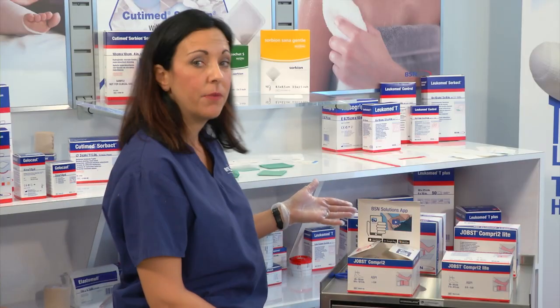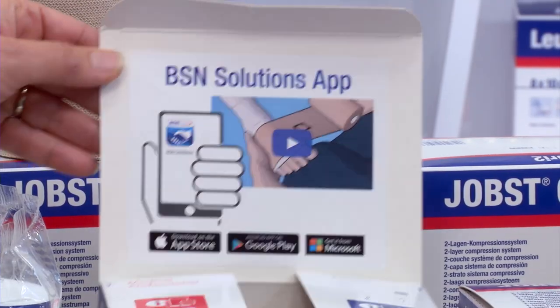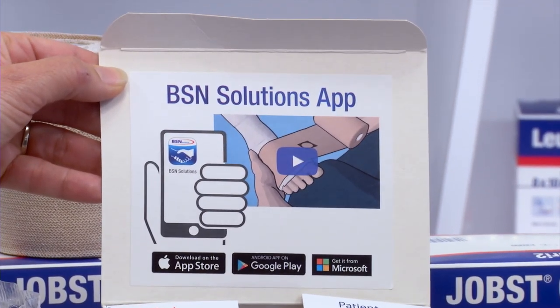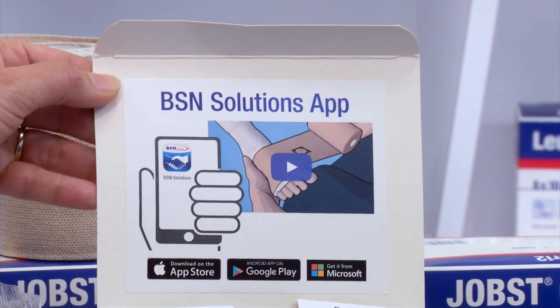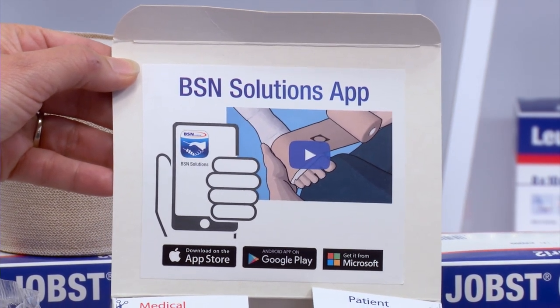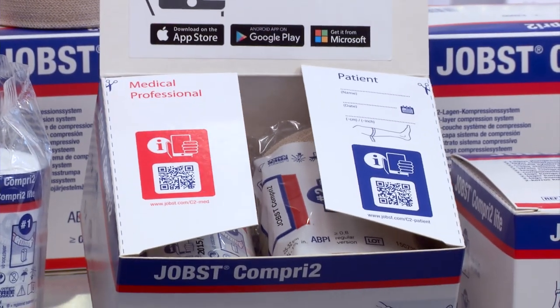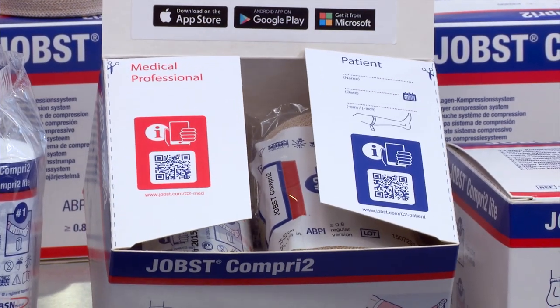I'd like to point out some features of the box. On the upper flap, you can see there's a BSN solutions app. If you go to this app, you would get an animated video with the application instructions. There's also a QR reader for medical professionals to get information, as well as a QR reader for patient information.